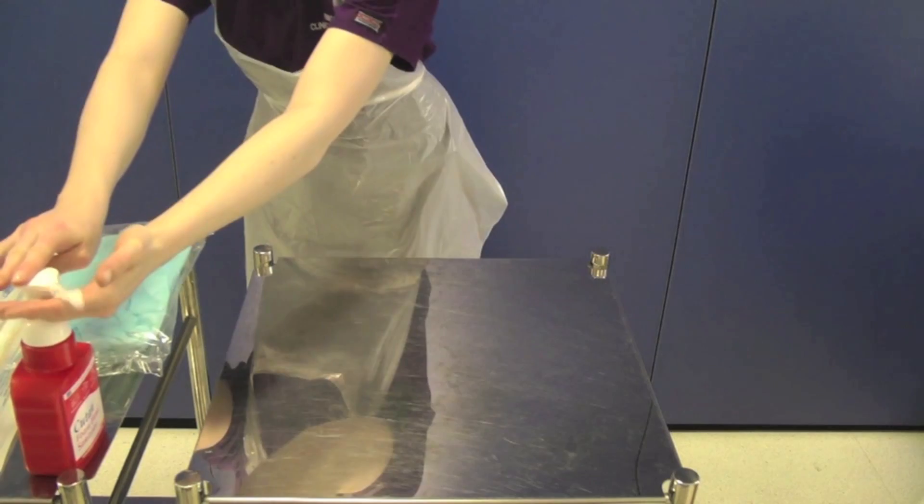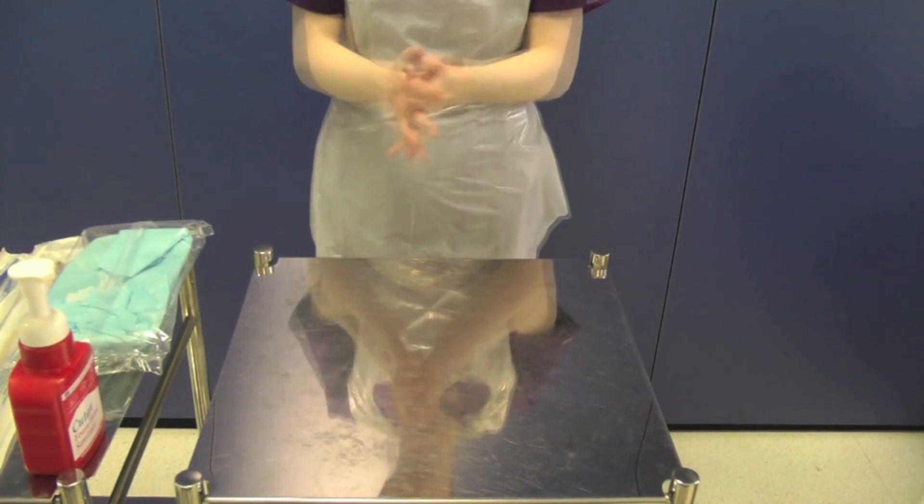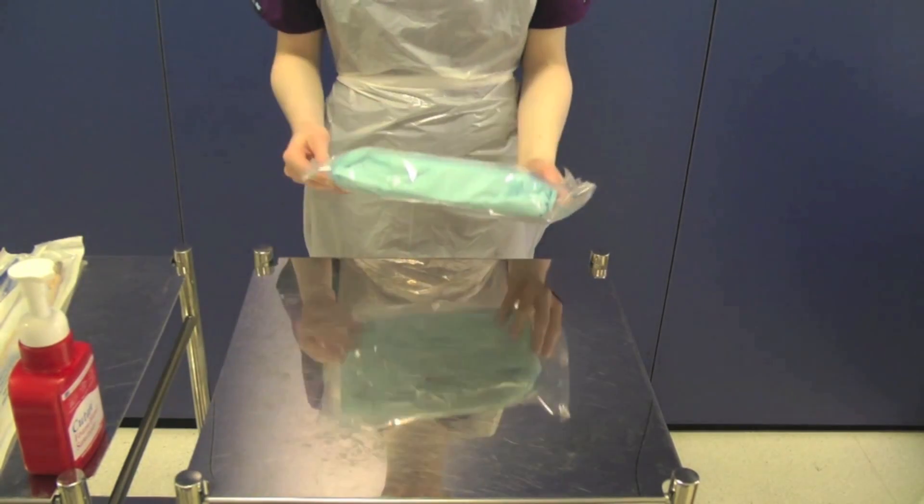Once you have cleaned your trolley, don an apron and decontaminate your hands using the WHO 7 stage hand washing technique. This must be used every time you decontaminate your hands.